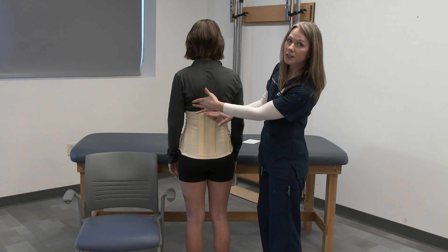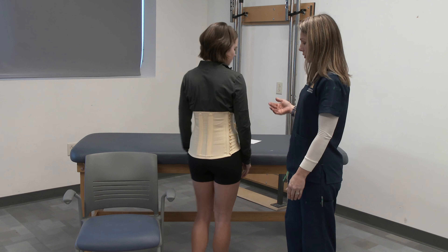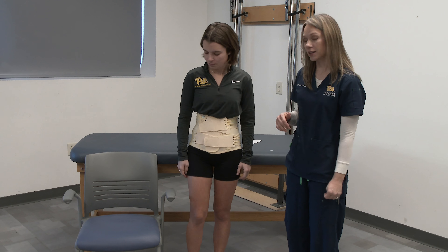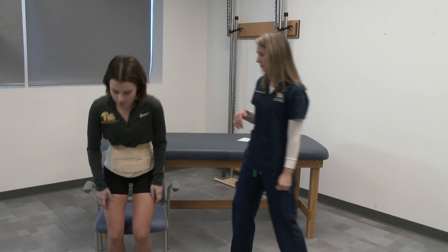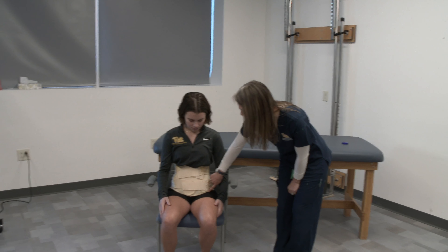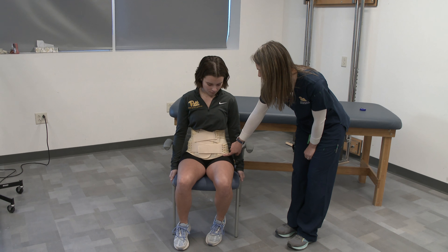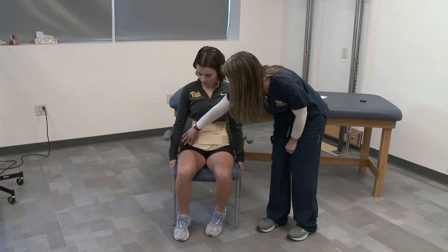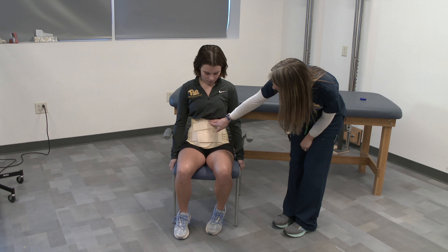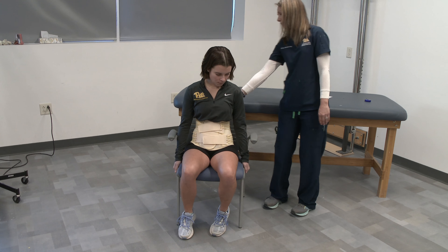To ensure a good fit, you want to make sure that it is snug enough and that it doesn't impinge on the xiphoid process. When she turns around, you want to make sure that it is approximately at the sacrococcygeal junction and that the inferior angles of her scapula are far enough away from the brace that it will not impinge.